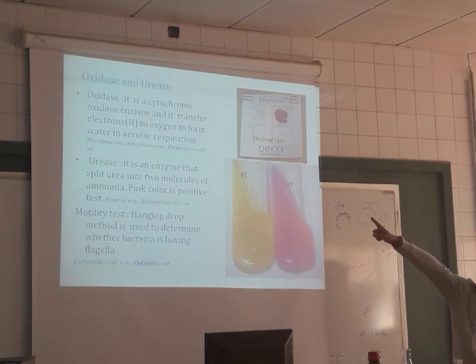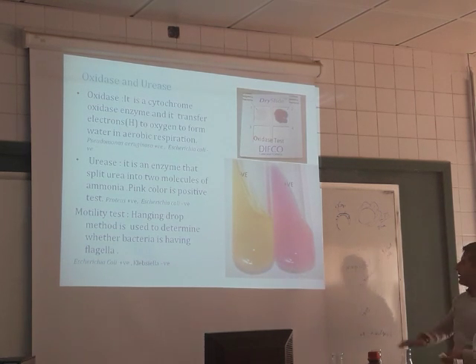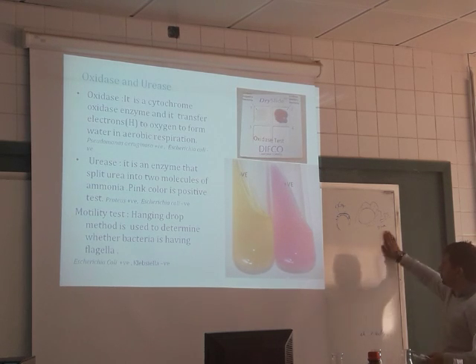To confirm this enzyme, there is a test. It looks purple in color. And finally, one more test is the urease. Some bacteria have the enzyme urease. What is the property of urease?